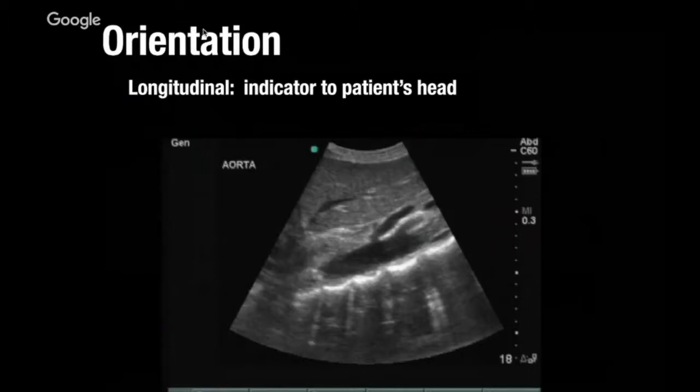Does anyone know what we're looking at? It's labeled on the screen. One of the orientations we'll lay onto this is where the beam is coming from. So this is a direct mid-sagittal shot. And we've got the belly and the back and the head and the feet.